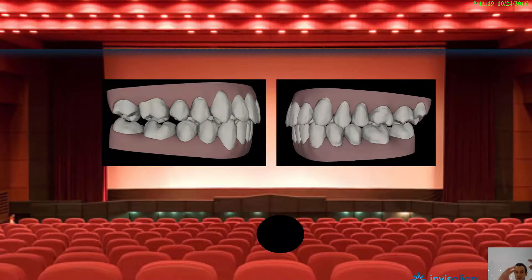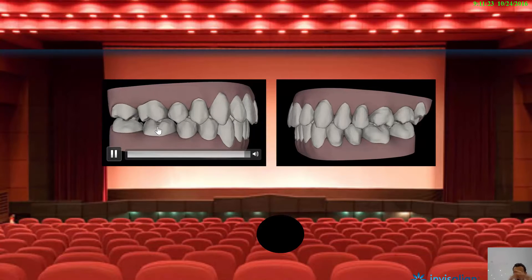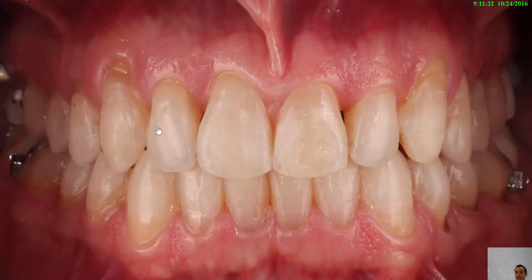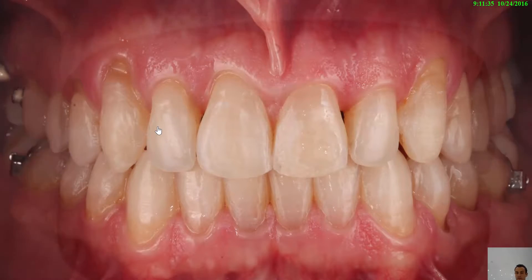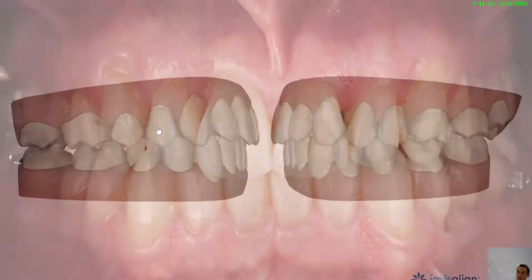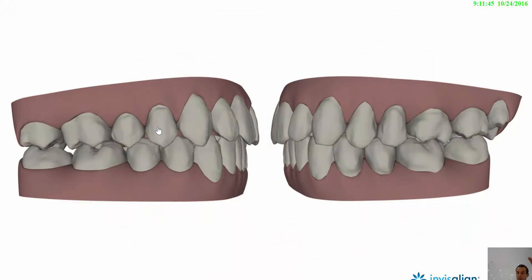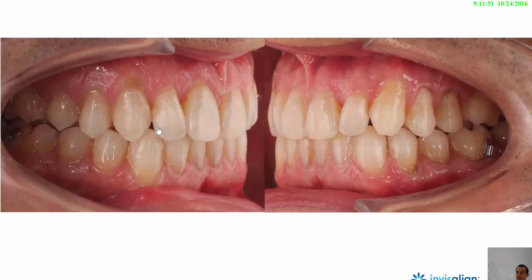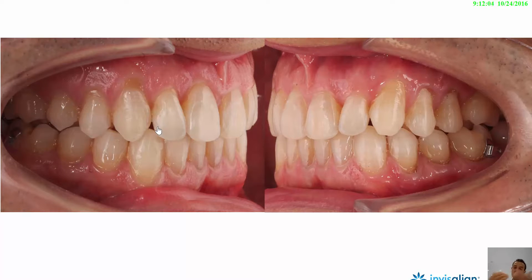After that we do the refinement, where we solve the occlusion. This is the final position I planned in my ClinCheck, and you can see that this is exactly what I achieved in my patient — exactly the same. If you do a good job you can achieve exactly the same. Look at the position I planned and exactly what I obtained in the mouth: Class I on both sides, and most importantly, look at the rotation — the canine is also better than at the beginning because I could also move the root inside the bone.